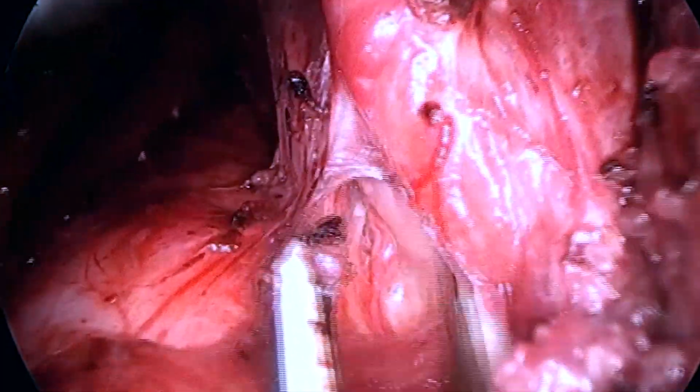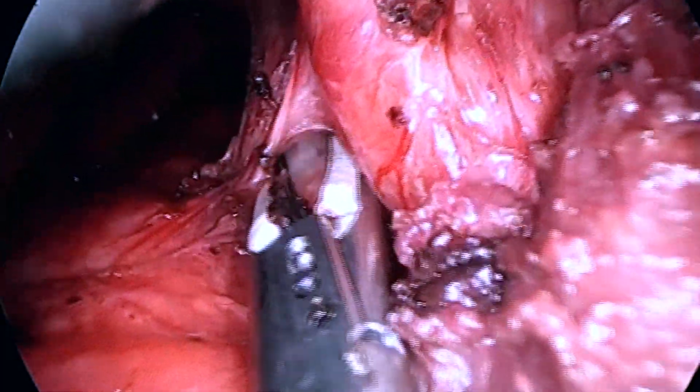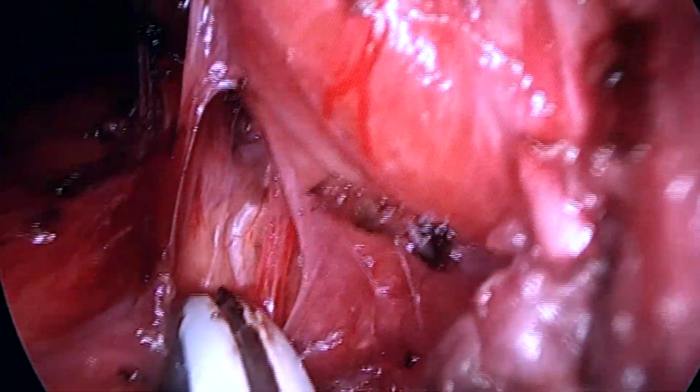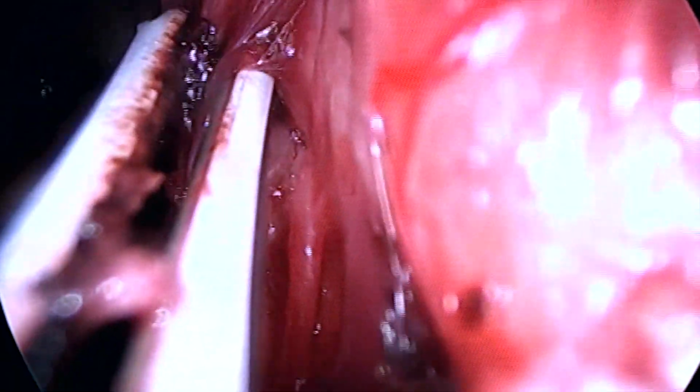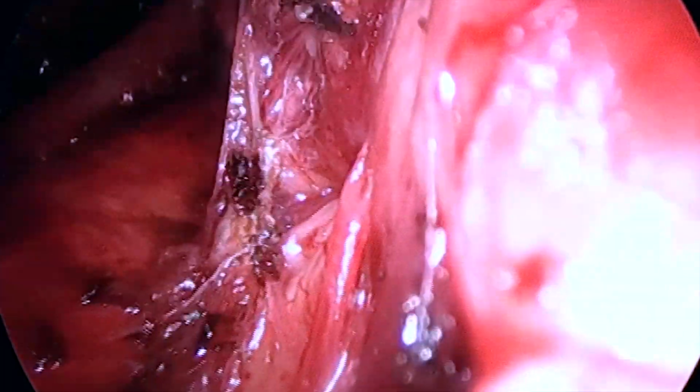A more mediolateral dissection into the Berry's ligament is then done to expose the recurrent laryngeal nerve. After identifying the nerve, a careful dissection of the Berry's ligament, maintaining and preserving the integrity of the recurrent laryngeal nerve, is done, which allows for further medial release of the specimen.